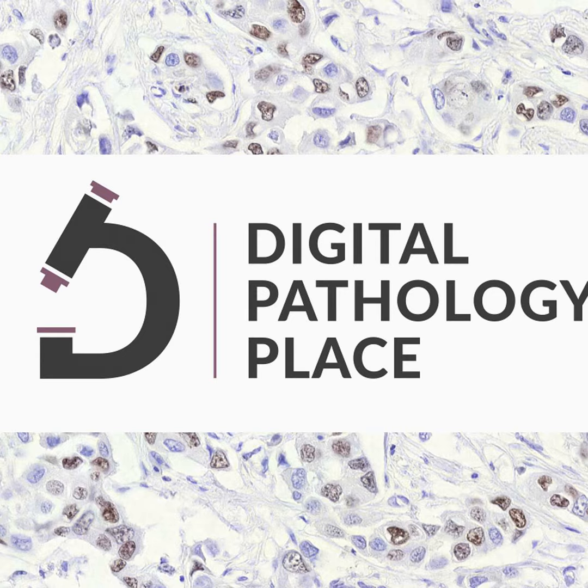One more thing, the lightweight self-supervised learning framework for domain generalization in histopathology. Yeah, so I told you at the beginning that at ACVP there was domain generalization discussion, and there's always somebody. So domain shift is when you have a model, and let's do the histopathology or pathology example, right? We need digital images for this. We need digital slides, right? So if you develop a model on digital slides from one scanner and then you change the scanner, you kind of shift the domain, and your model does not perform that well on this new slide.